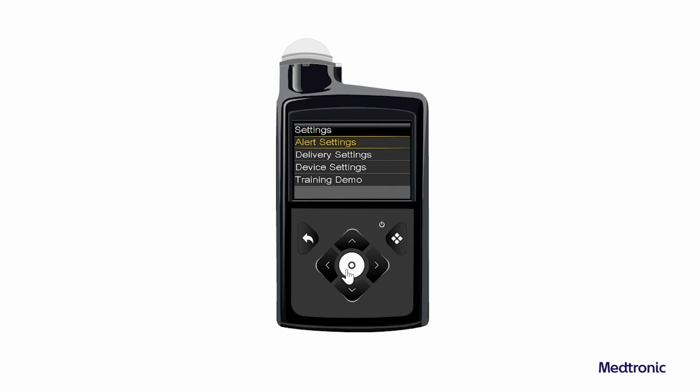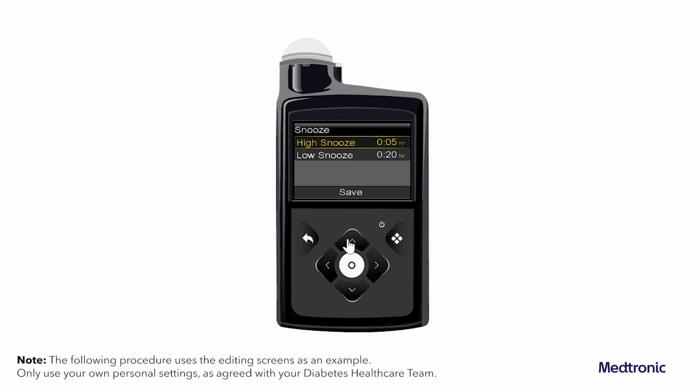Select Alert Settings and then select Snooze High and Low. The snooze screen appears. Select High Snooze and enter a time in 5-minute increments from 5 minutes to 3 hours. Select Save.